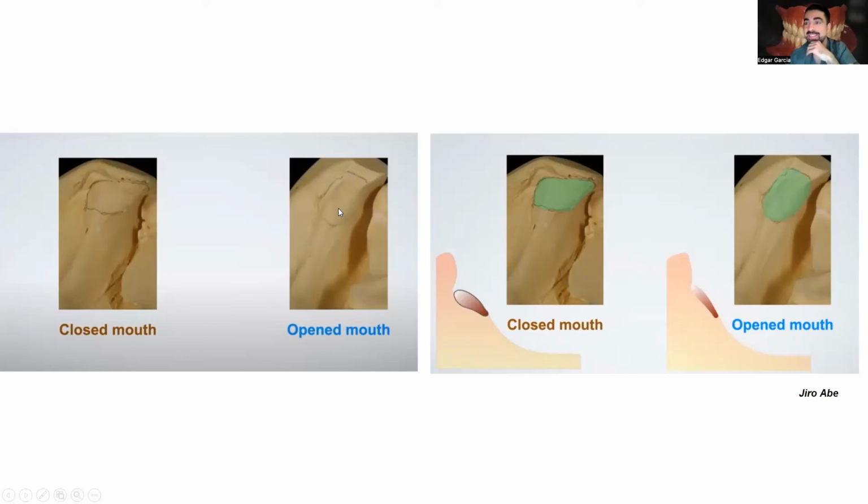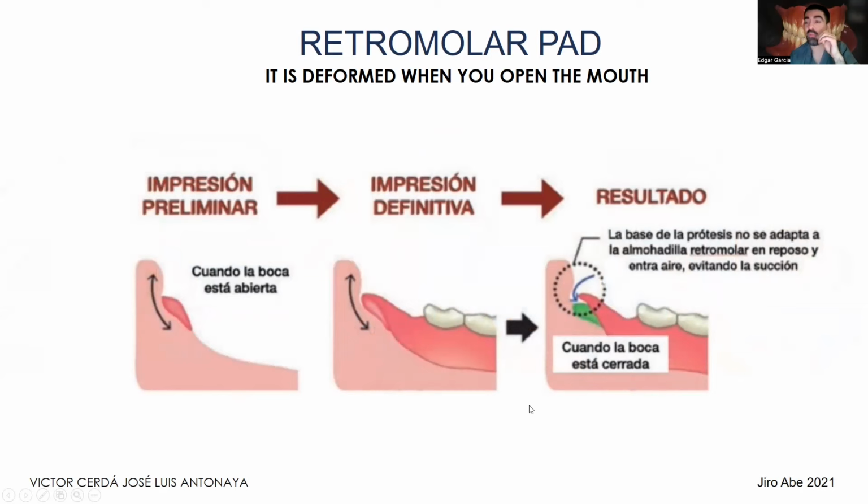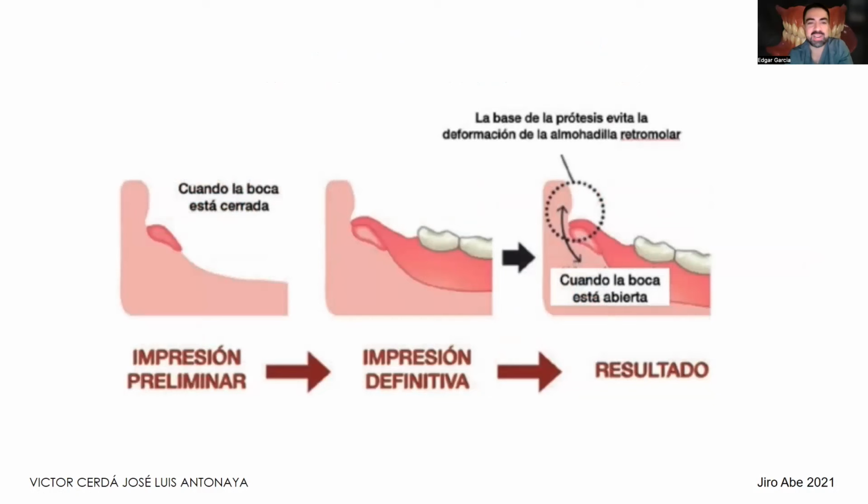The retromolar pad. And this will directly affect our retention, because when the mouth is open and we take the impression with the mouth open and make the denture like this, when the patient puts the denture in their mouth, there's going to be a space, as you can see in this part of the slide. Because the patient does not go through the day like this. The patient has the mouth closed almost all day. Unlike when we take the impression with the mouth closed, we're going to have that area sealed, okay?